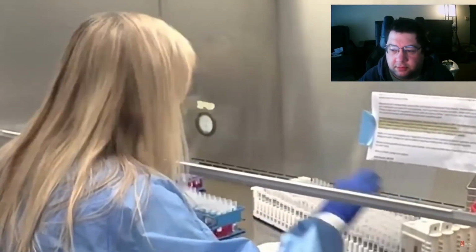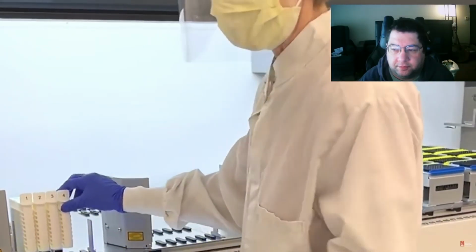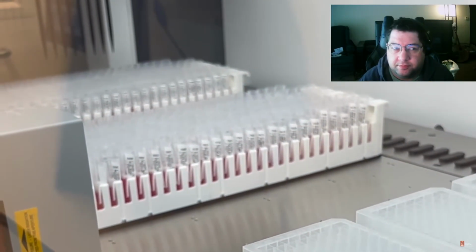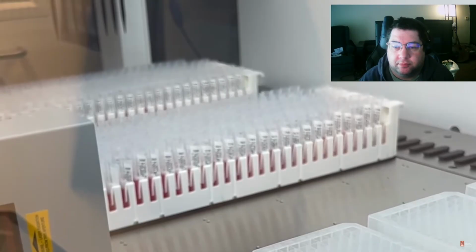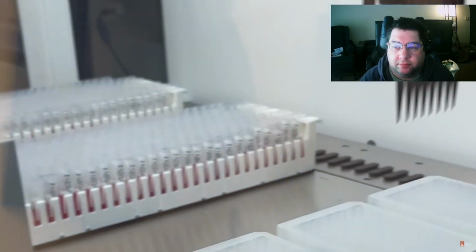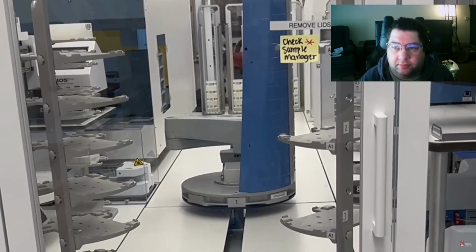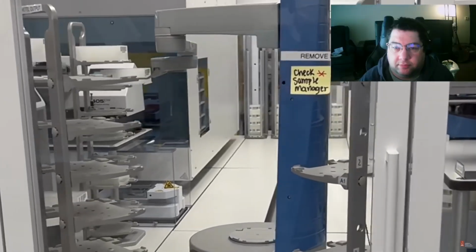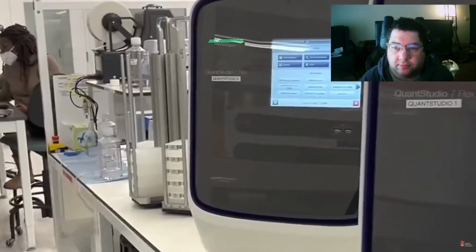We perform COVID-19 testing using the Amplitude system. This is an automated, high-throughput molecular diagnostic system in which up to 376 samples can be processed per batch, which takes about 3 hours. The system utilizes 2 modules for specimen processing. First, samples are transferred from tubes to plates by a liquid handler system. Then, by use of a robot arm, the plates containing patient specimens are processed for RNA extraction and PCR analysis to detect gene targets of the SARS-CoV-2 virus.